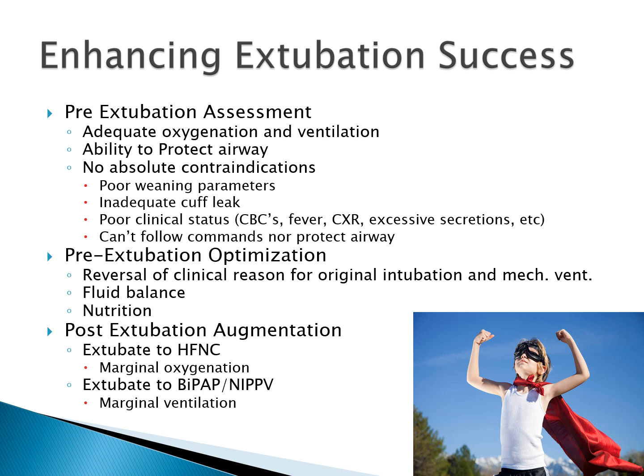A lot of the ventilators today, the invasive ventilators, can also double as non-invasive ventilators. So it's something that we do. We'll extubate, not having the whole BiPAP in the room. You can actually just use the 980 to ventilate them non-invasively. You're just going to make sure, obviously, you're in the right settings, and that you're using the correct interface.